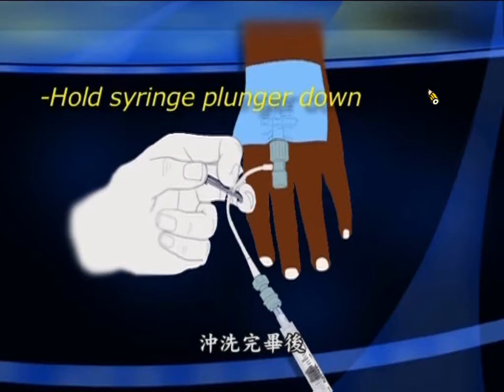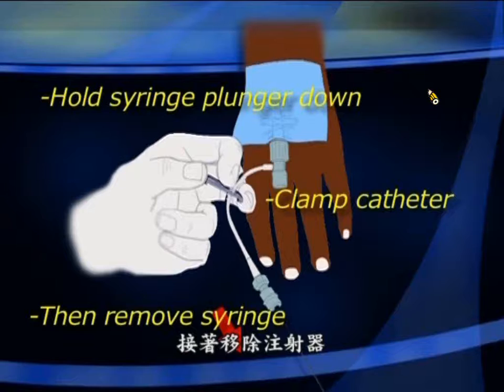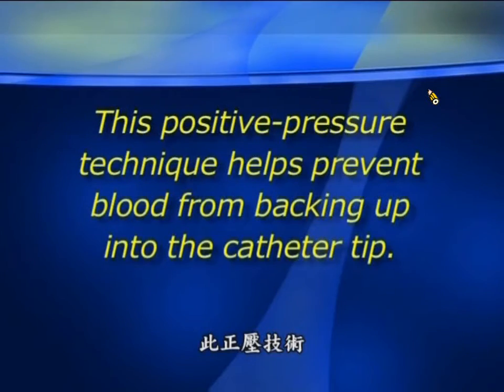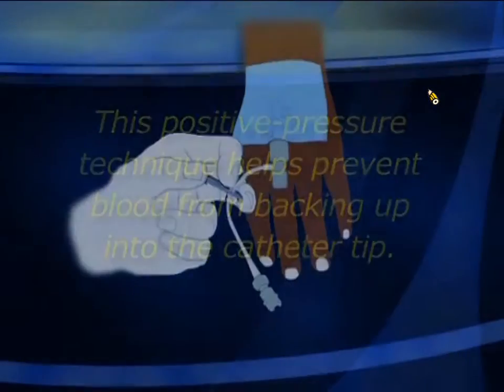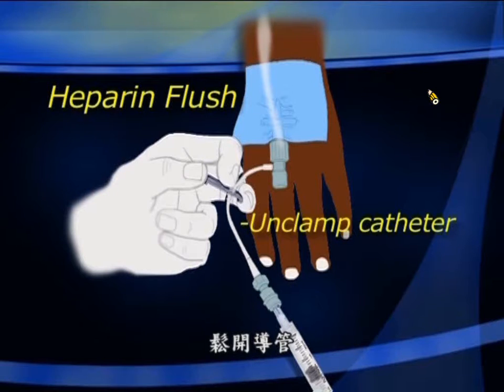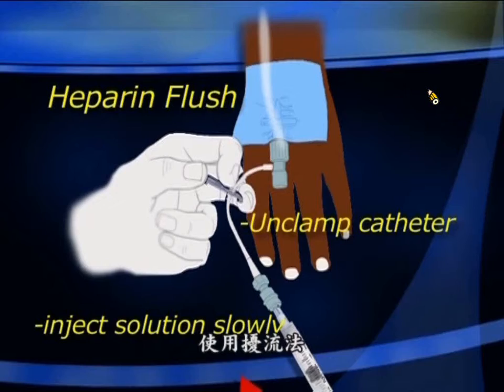When the flush is completed, hold the syringe plunger down, clamp the catheter, and then remove the syringe. This positive pressure technique helps prevent blood from backing up into the catheter tip. If a heparin flush is ordered, unclamp the catheter and inject the solution slowly through the infusion port, using the turbulent flow and positive pressure techniques.